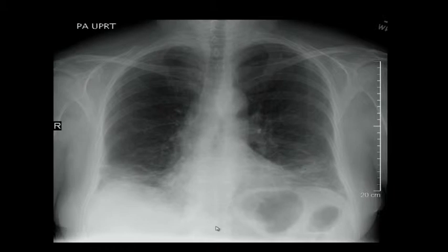Is this exclusively interstitial, Tope? What is it? Is it only interstitial? Remember one thing: if there are only interstitial opacities, the density of the underlying lung should not change. You should just see white lines through a normal black background. But that's not the case here, right, Tope? Black, white.